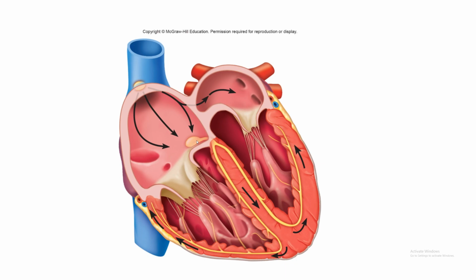Your PR segment is going to be a little section back on the isoelectric line between your P wave and your first downward deflection, right? So after this conduction meets the AV node, it's going to move into another structure called the bundle of His, right? Your bundle of His is then going to lead into what's called the left and right bundle branches.